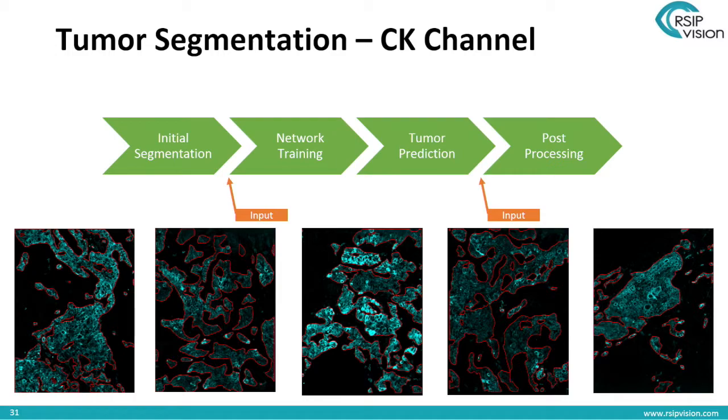From a computer vision guy's perspective, you sort of need to zoom out, to squint, and to look at the areas, but you still want it to be accurate. You still want to get holes in this region correctly. So here, again, the architecture itself is actually pretty similar. It's also a segmentation task. You're just training it on a different type of ground truth.